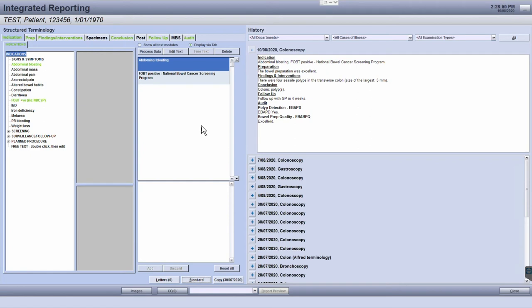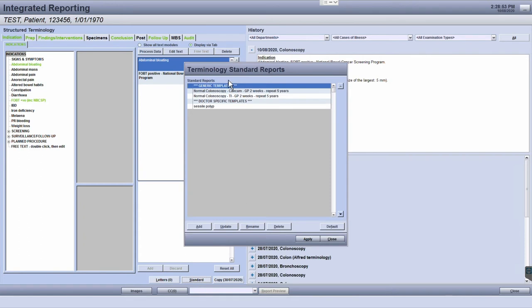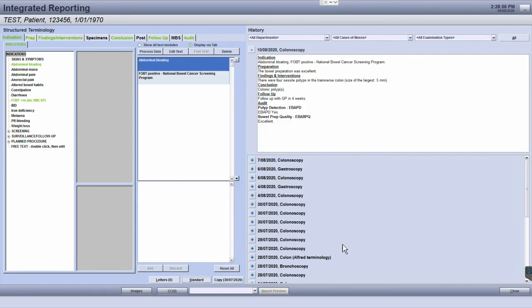First, you'll need to populate the report in the terminology screen as you would like the standard report template to be saved.